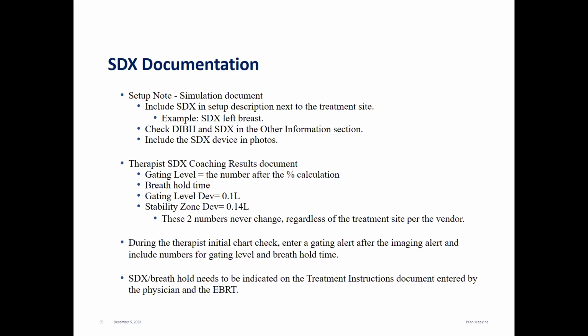So you're going to say whether the patient can hold for the 30 seconds or the 25 seconds. Then you're going to always enter that gating level and that stability zone level. Again, those 2 numbers never change. They are from the vendor. So the gating level is always 0.1 liters and the stability zone is always 0.14 liters.